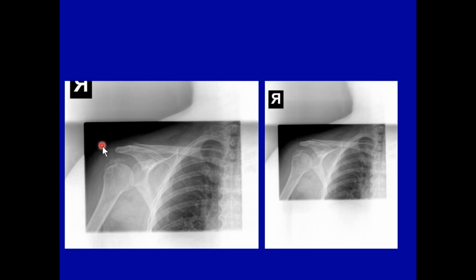Now notice that this is digital. They did collimation on 4 sides, which is great. I mean, this is a 10 out of 10 shoulder x-ray in my mind. It was well done. We had a little issue with the positioning, understood, but even on a digital x-ray, with collimation, look how much scatter radiation is affecting the neck and the lateral part of the shoulder.